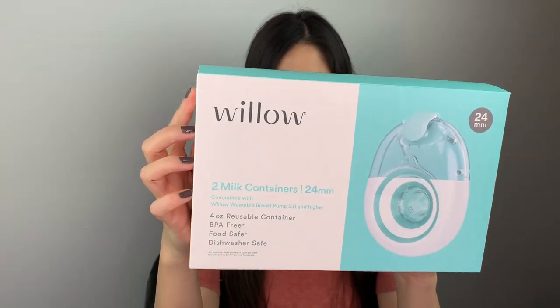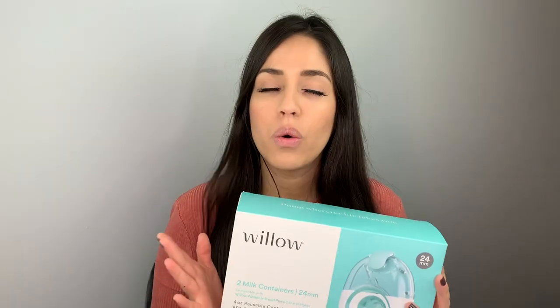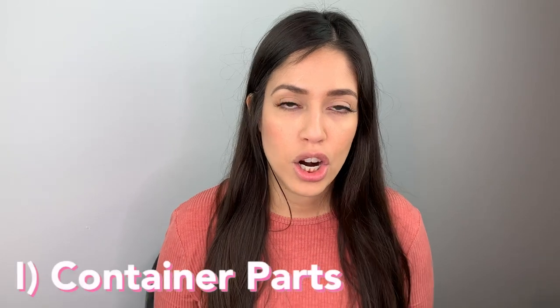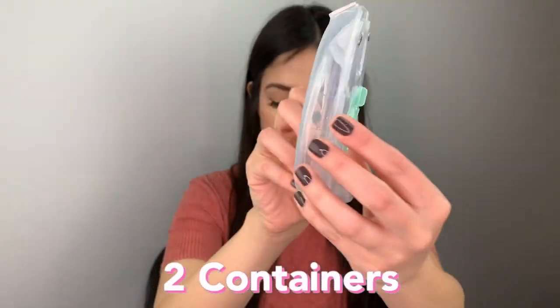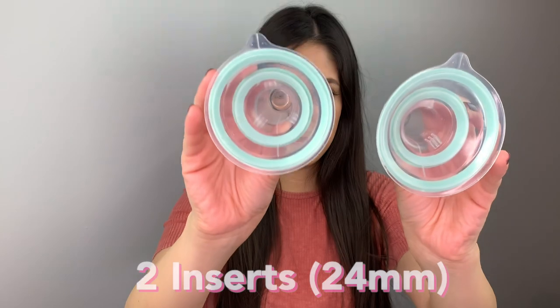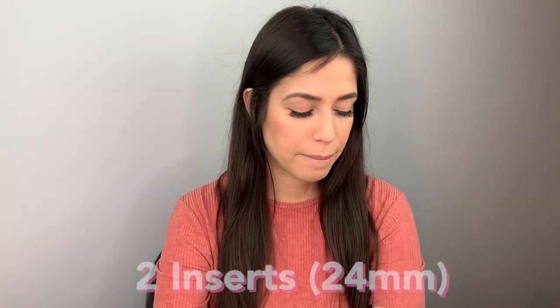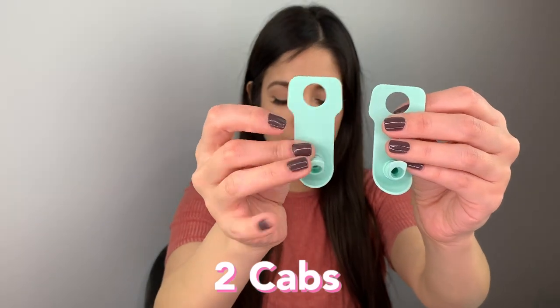So this right here is the Willow pump container — this is a 24 millimeter one. I love how Willow packages all their items; it's so slick, it kind of reminds me of Apple. Let me start by detailing everything that came with the container. I got two containers, two inserts, and two caps.